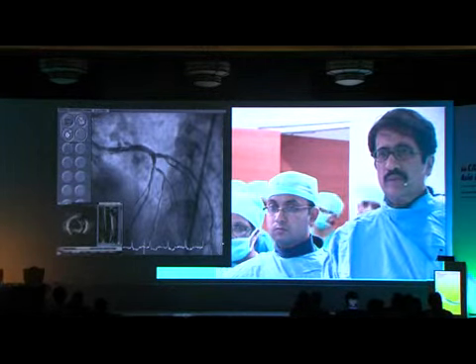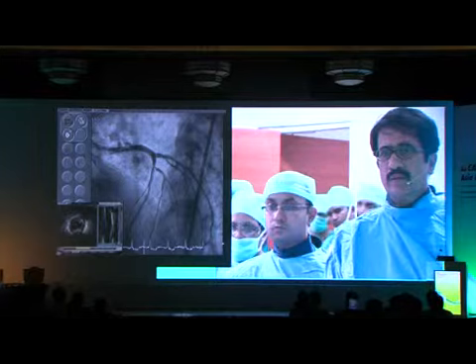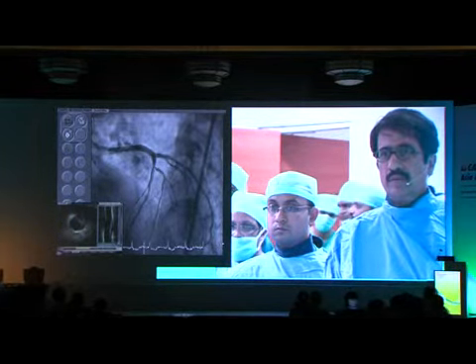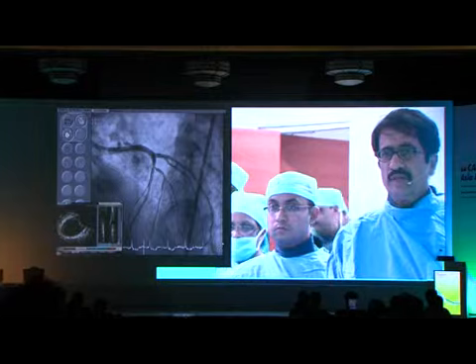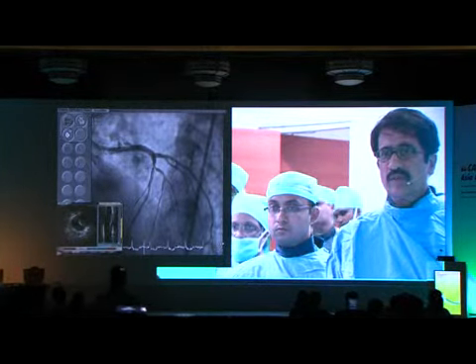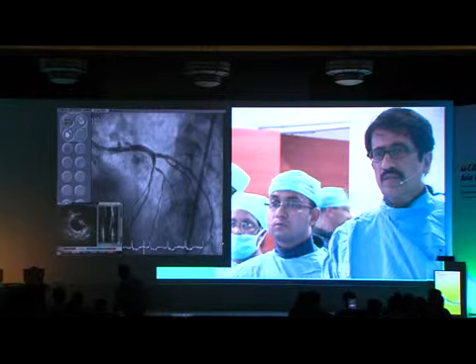Just freeze that diagonal origin. Go distal a bit. See, this is the LAD, just distal to the origin of diagonal.